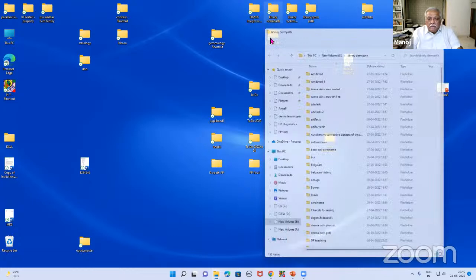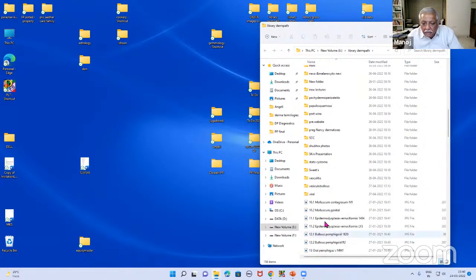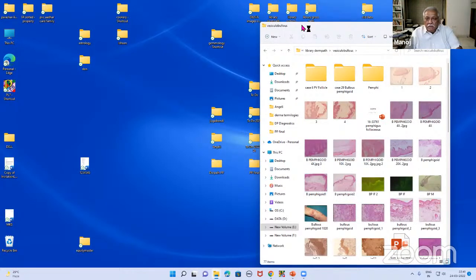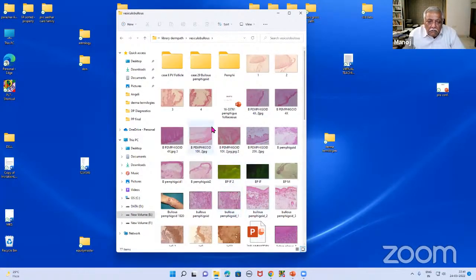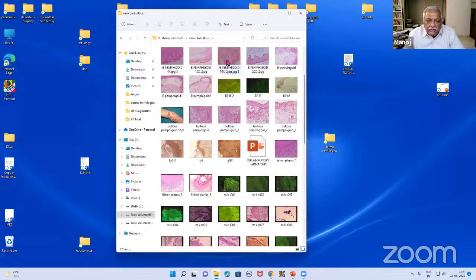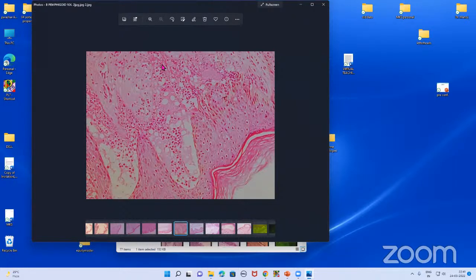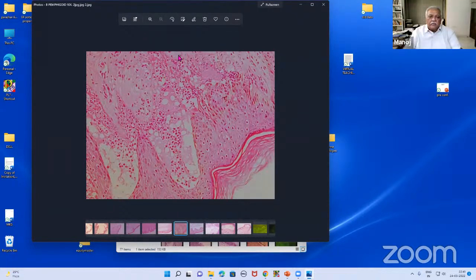Actually, I'd shown you these slides. Epidermis, everybody can see this? Yeah. Epidermis here, bulla cavity here, and then a little bit of dermis here. Dermis is out of this section. This is a dermo-epidermal section with the bulla in between. The entire epidermis has come out here.